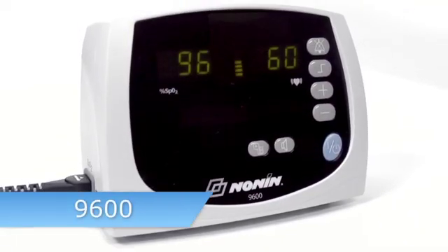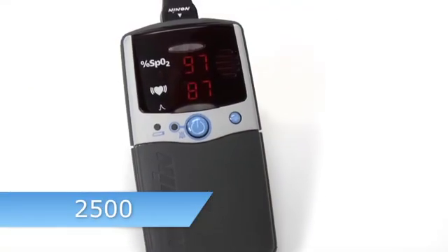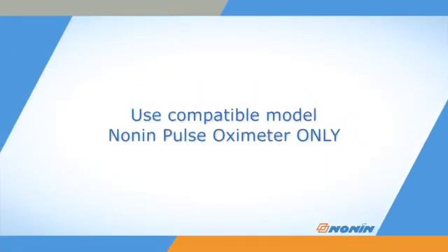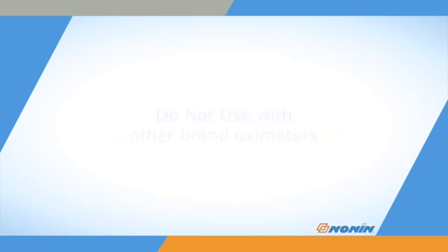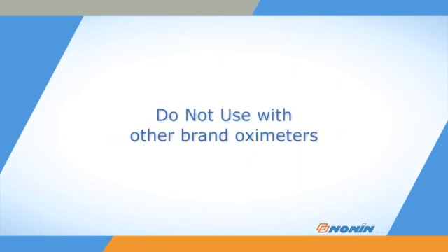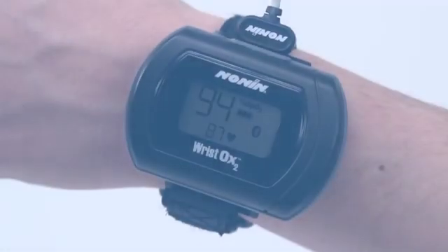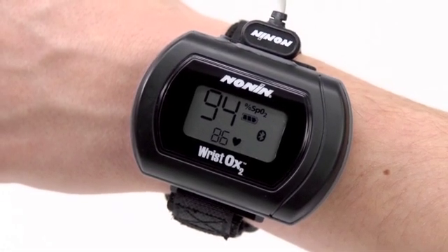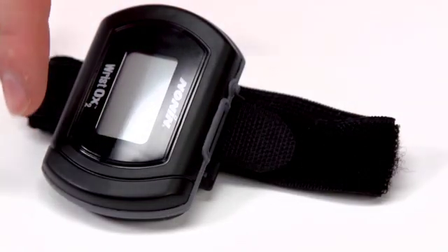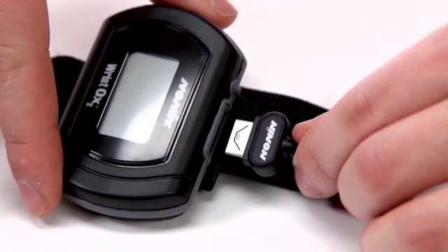8000JWO2 sensors are designed for use with Nonin brand pulse oximeters only. Do not use Nonin brand sensors with other brand pulse oximetry devices which may provide inaccurate results. 8000JWO2 sensors are specifically designed for the Nonin WristOx2 oximeter with a shorter cable length and special connector.